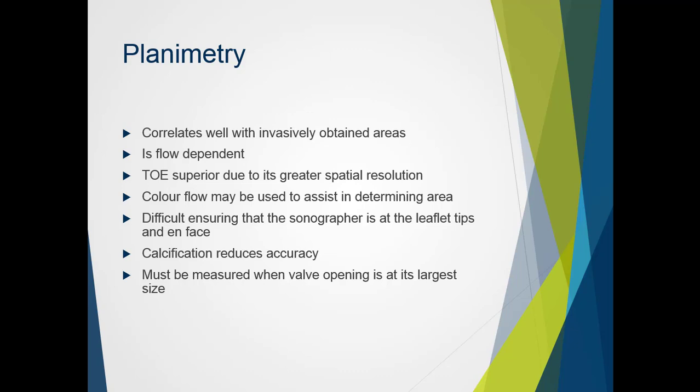Planimetry is an easy method that correlates well with invasively obtained areas when performed appropriately. It is important to note that this method is flow dependent in that the leaflets open less in the presence of significant LV systolic dysfunction and may not be a true reflection of the valve stenosis severity. Transesophageal echo is a superior modality due to its greater spatial resolution and fewer obstructions to attenuate the ultrasound beams, and can make it a little bit easier to do our planimetry measurements.